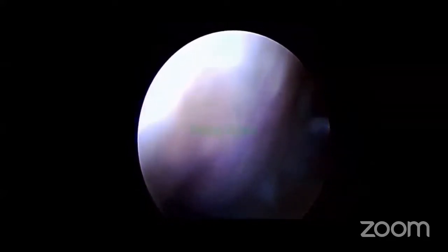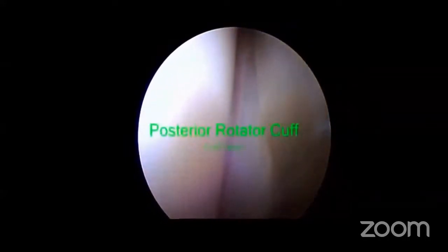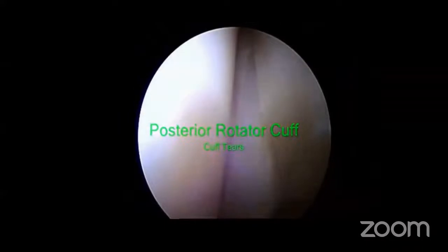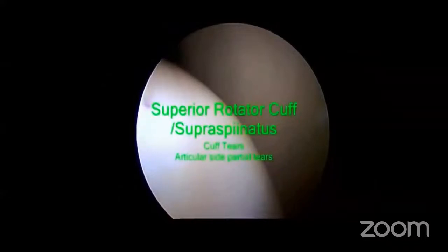Now, as you start moving superiorly, you see the bare spot of the humeral head, and a little bit more superiorly, you'll see the attachment of the posterior rotator cuff. This is where you will be able to appreciate the posterior extent of the cuff. Now, as you're moving more superiorly, you start observing the entire attachment of the rotator cuff from the articular side.